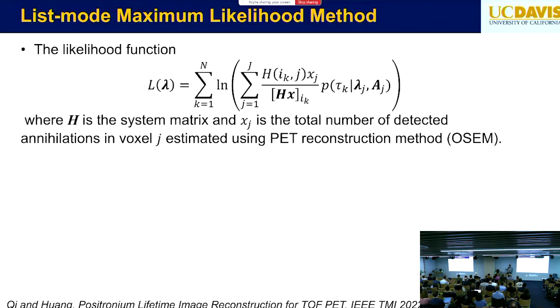Of course, for people sitting here, we all know it's not that hard to formulate the problem once you can write out the likelihood equation, right? So we basically write the likelihood equation here. We only have the lambda, so that's the focus. For the lambda, essentially we can write it out as a time histogram, weighted by this fraction calculated based on each emission from each voxel.